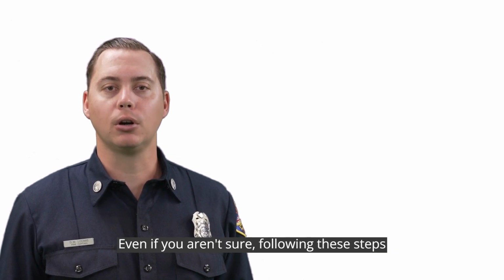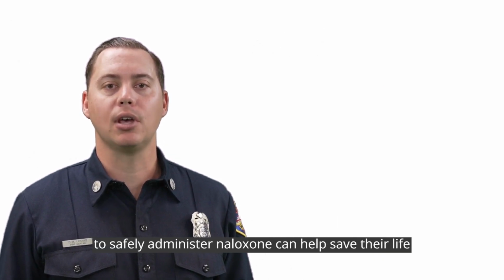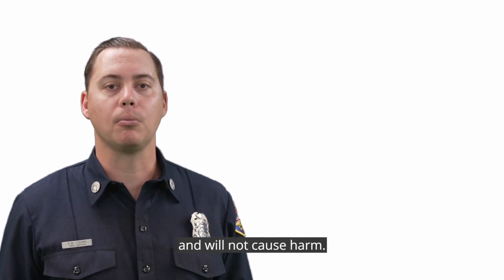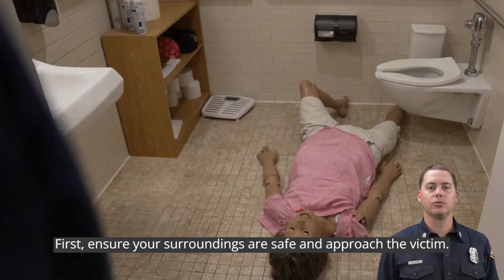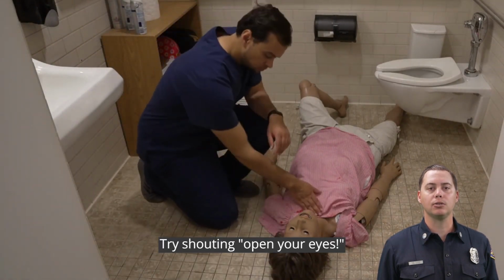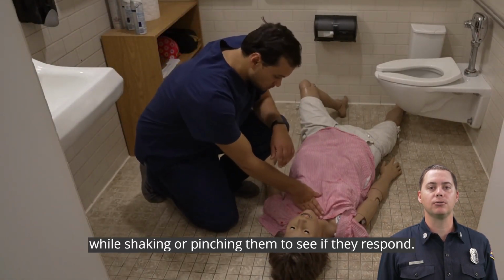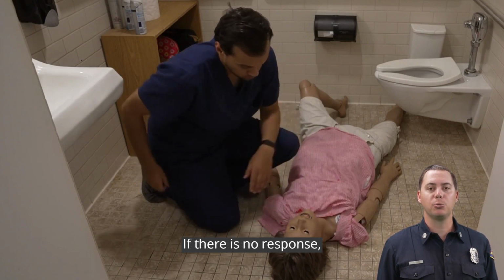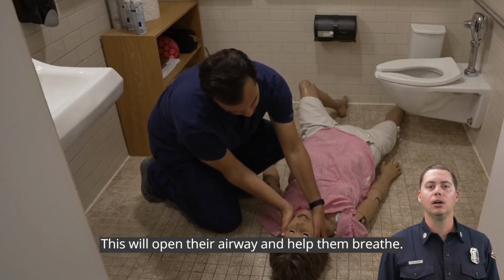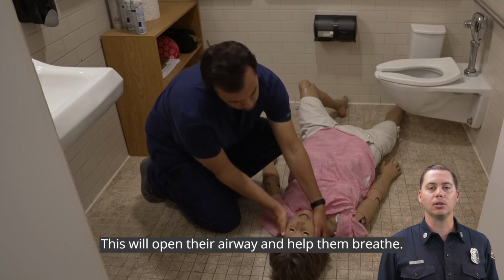Even if you aren't sure, following these steps to safely administer naloxone can help save their life and will not cause harm. First, ensure your surroundings are safe and approach the victim. Try shouting, "Open your eyes," while shaking or pinching them to see if they respond. If there's no response, lie them on their back and gently tilt their chin towards the sky. This will open their airway and help them breathe.